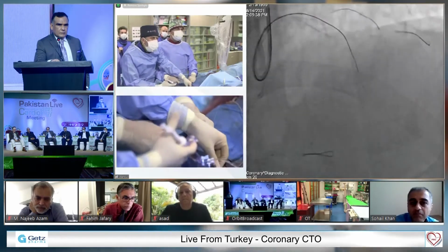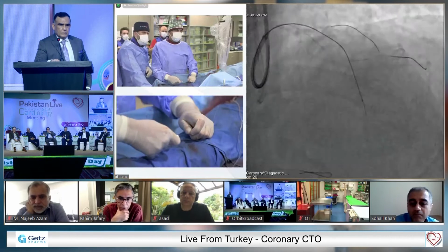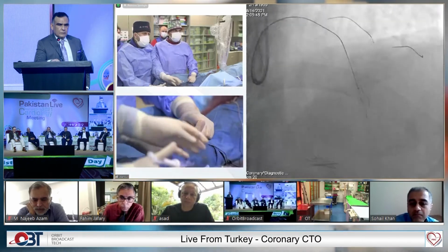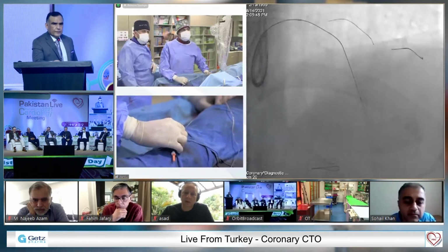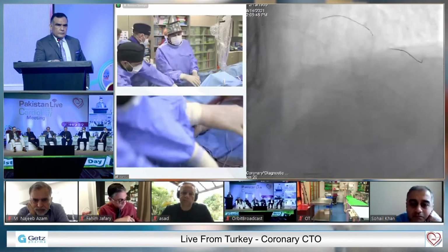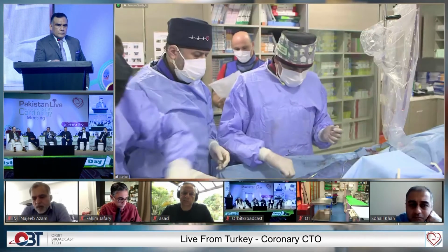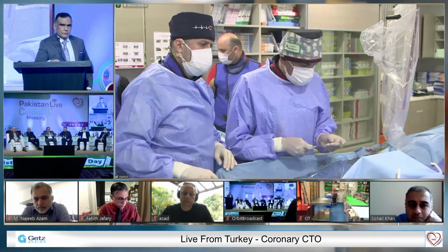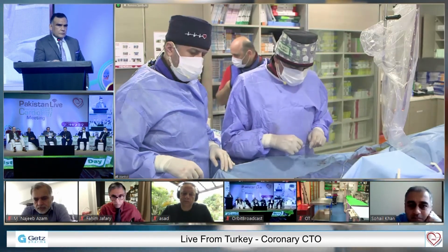All right. Yes, please. I think the other thing about the Conquest is that the trackability and directionality is very poor, it'll basically puncture and go wherever it wants. So once you have a wire, the Gaia series is much better. Lastly, I try Miracle 6. If I fail, I go retrogradely. I have nice collateral, so I think I have a chance for recanalization now. At least I have a wire antegradely and I have a good retrograde option.